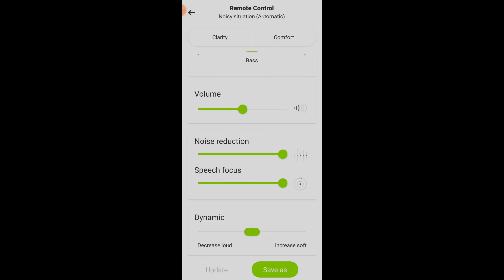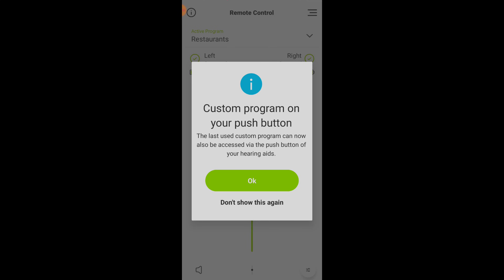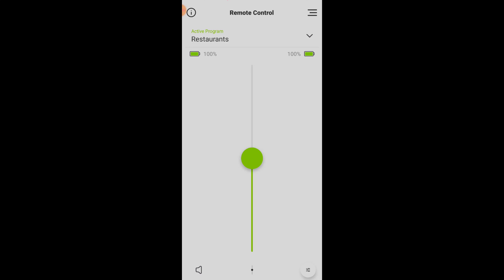Finally, I would make an adjustment inside the Dynamic section to decrease loud sounds. This will adjust the compression settings to give less amplification to loud restaurant noise. Once you find the combination of settings you prefer in that particular situation, again, you have to make sure that you save this as a custom program so your hearing aids lock in those settings. The nice thing about saving these as custom programs is that you can access them again in the future if you find yourself in a similar listening situation.